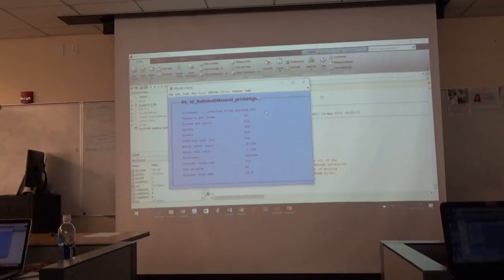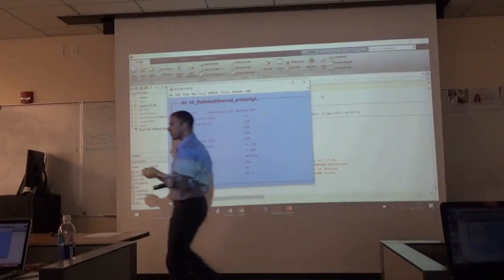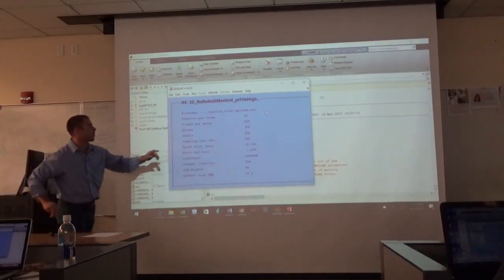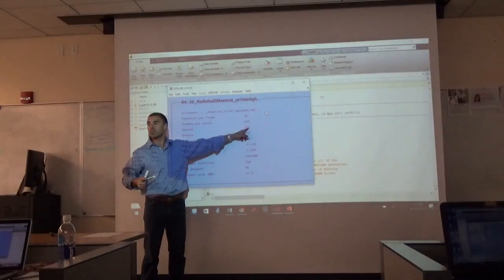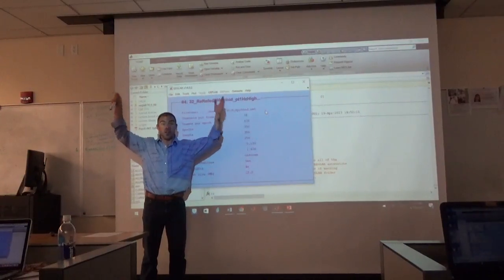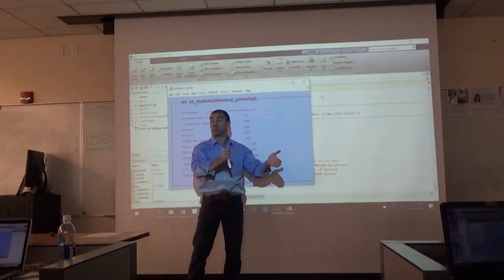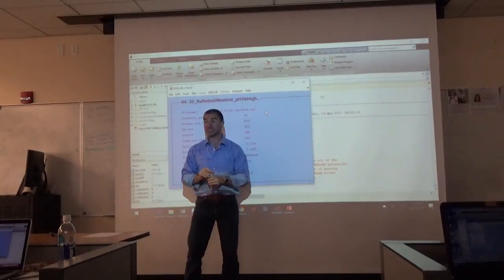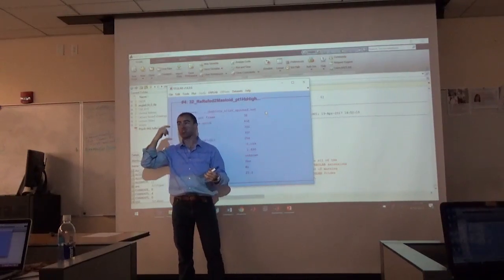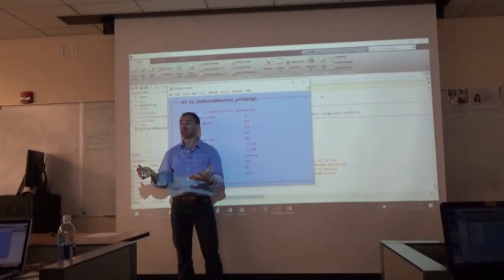Worked good for you too. Still batting 1,000. 100% success rate. Okay, so this is really good. Now, what does that mean? What does it mean now that we went from 1 epoch to 300? We have more bits and pieces of it. Yeah, we didn't shrink it. We sliced our one long period of EEG into 300 discrete little windows, basically of when stuff happened. Because that's what we're trying to figure out: what's happening in the brain when stuff happens on the computer screen. Everybody on board with the idea and the concept?